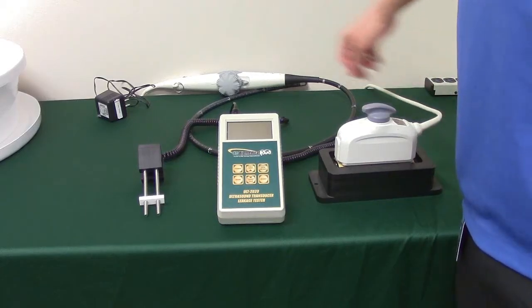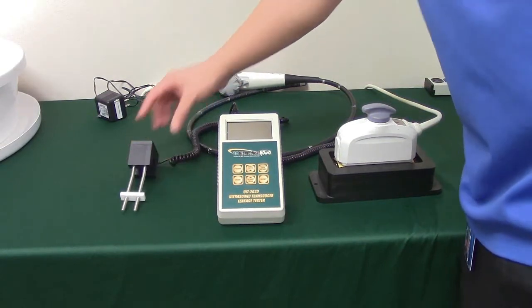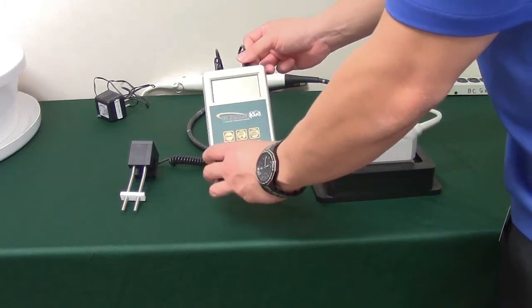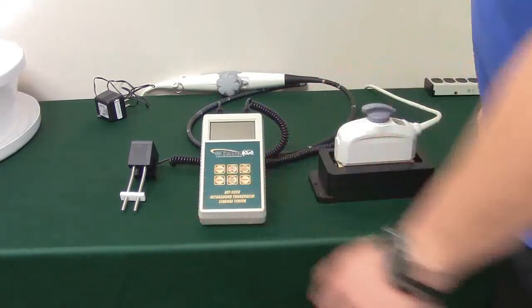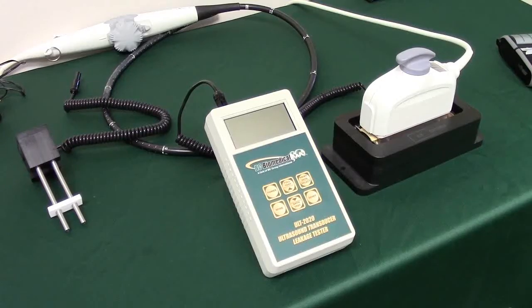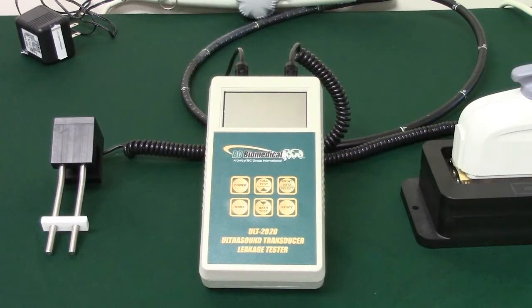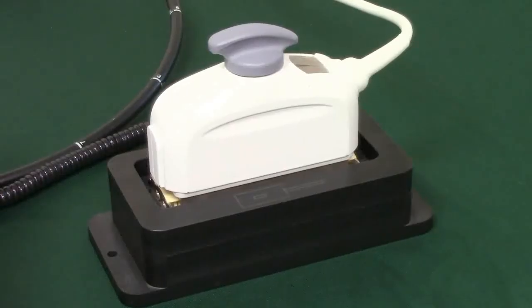Once that is attached, plug your dual-prong conductivity probe into the second port on the top of the ULT 2020. You can use either port. Now, all parts should be fully connected. This includes the ULT 2020, dual-prong conductivity probe, transducer adapter, and ultrasound transducer.